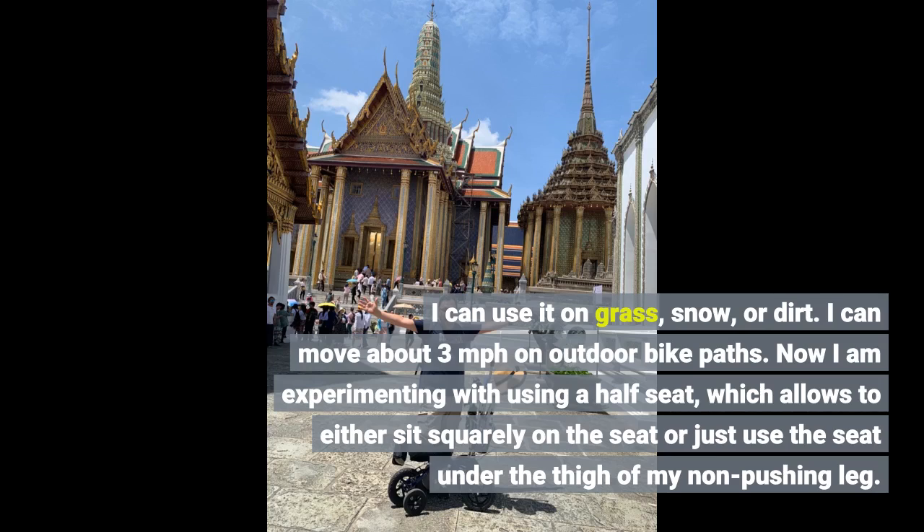Now I am experimenting with using a half seat, which allows me to either sit squarely on the seat or just use the seat under the thigh of my non-pushing leg.